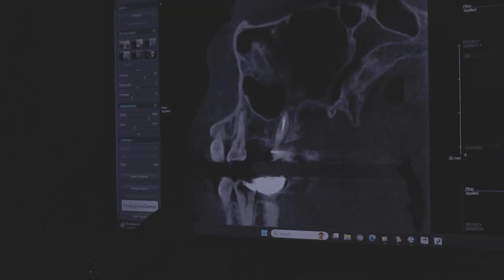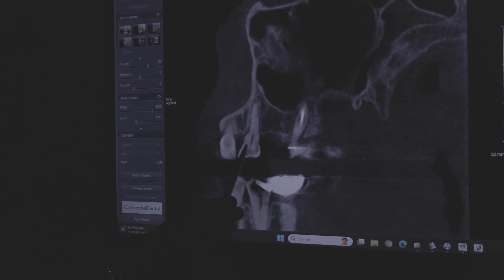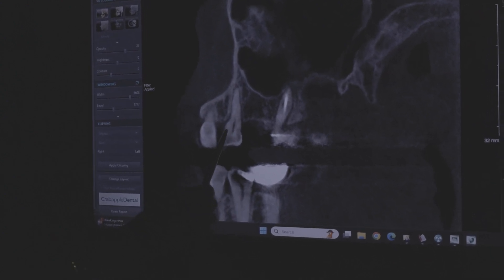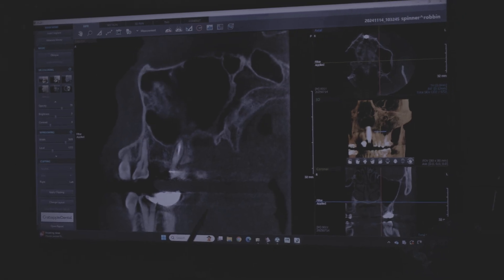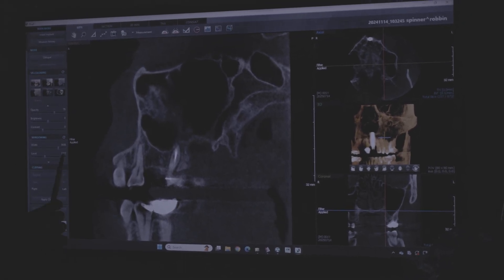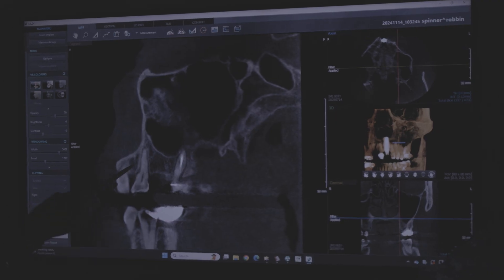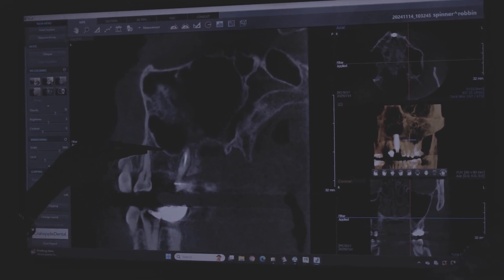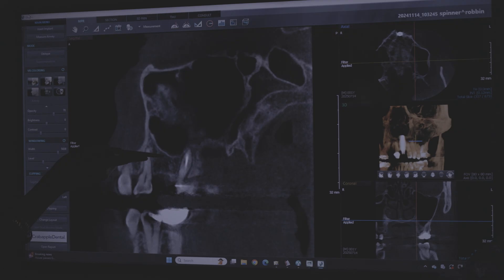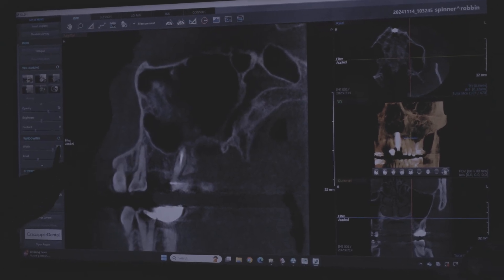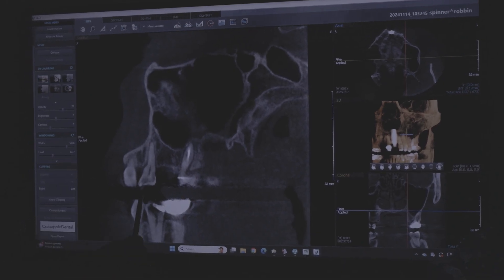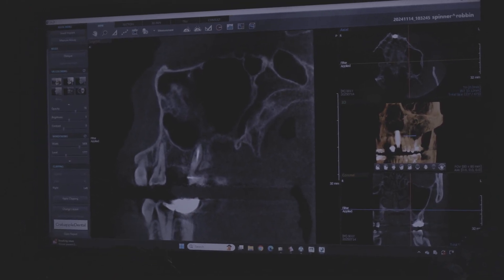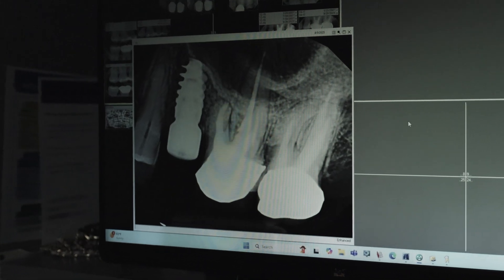This is a CT of Robin before the implant was placed. If you look at the screen, you can see all the different views — the axial, 3D, coronal, and the sagittal view. It shows the distance between the base of the bone and her sinus, so we know exactly the correct width and depth the implant needs to go to in order to serve as a solid anchor and long-term tooth replacement.